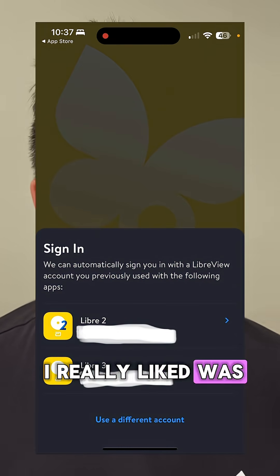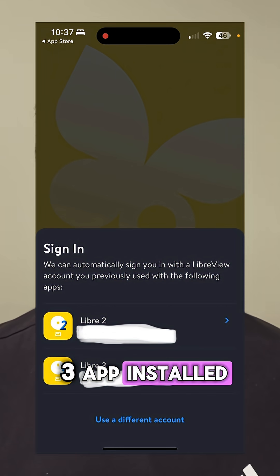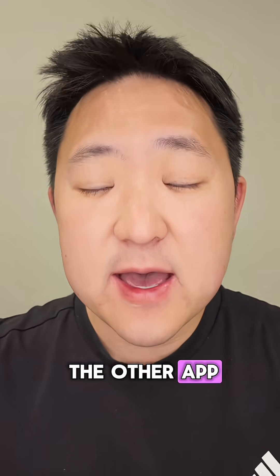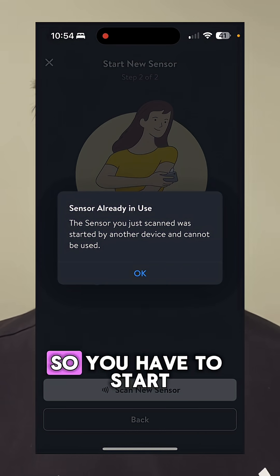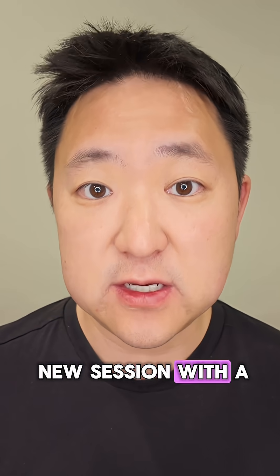A couple of quick practical tips. Number 1, one thing I really liked was that when logging in, it automatically pulled in your login credentials if you have the Libre 2 or Libre 3 app installed, which I thought was really nice. However, if you have an active session running on the other app, I tested it out and it can't take over the existing session. So you have to wait to start using the Libre by Abbott app until you're starting a new session with a new sensor.